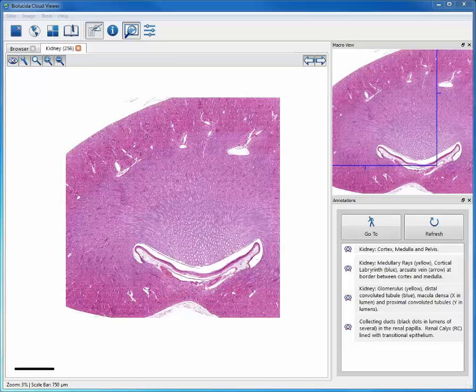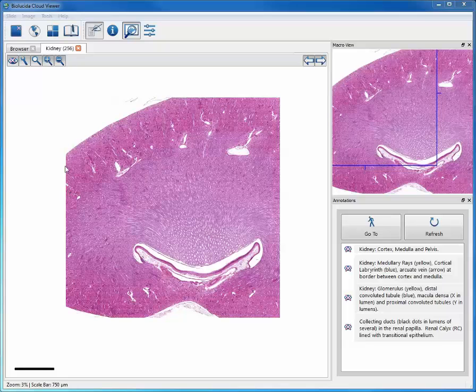A specimen of kidney from a monkey. You can see the cut surfaces here where a razor blade or some sharp instrument cut the specimen here and here and here and across the bottom here.